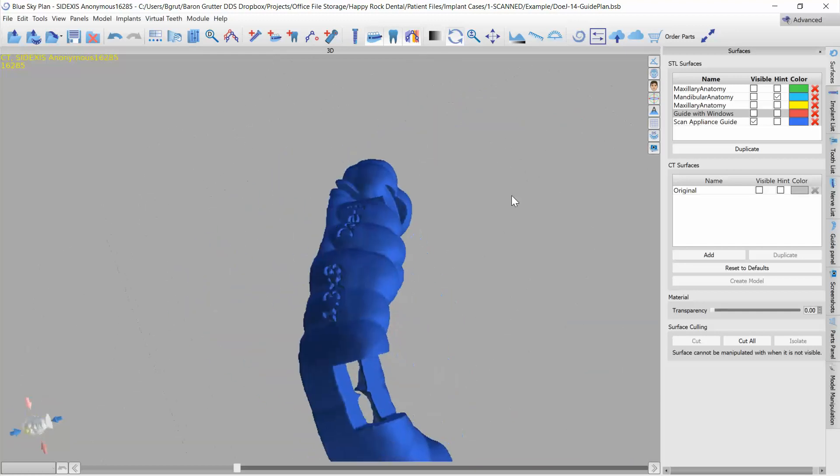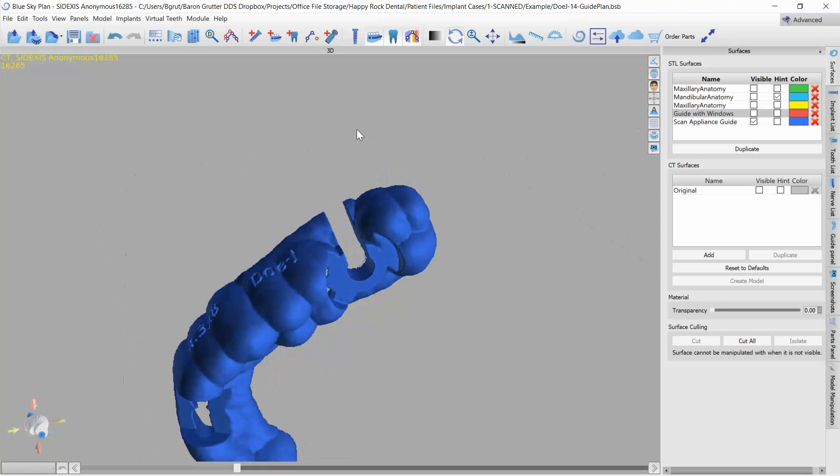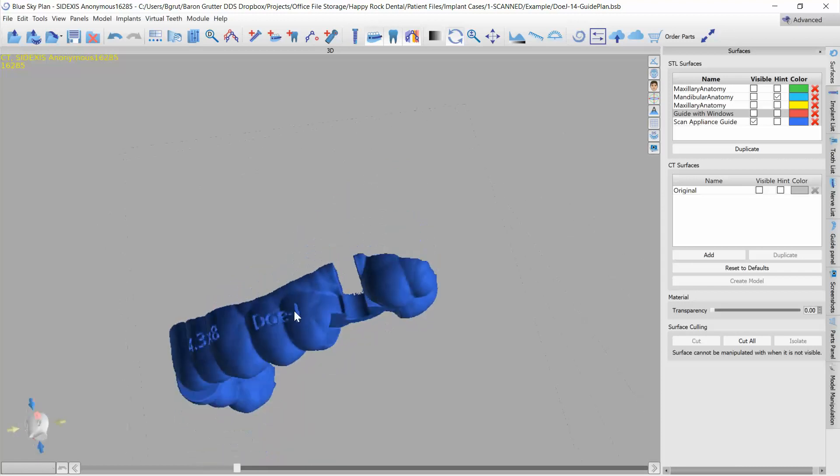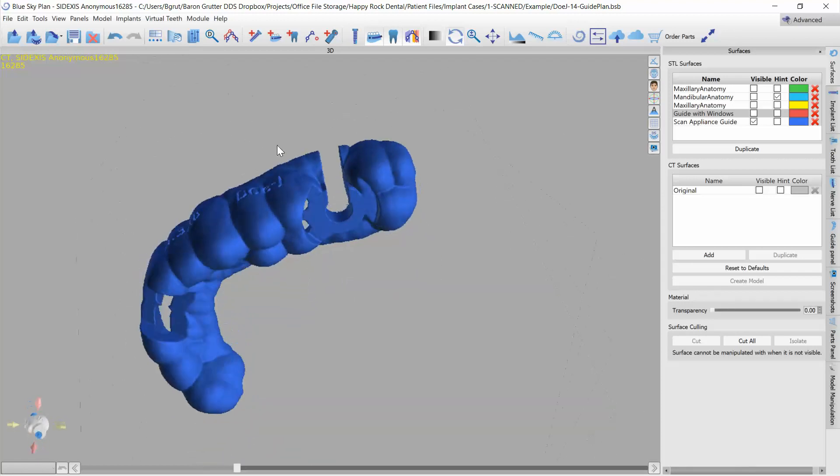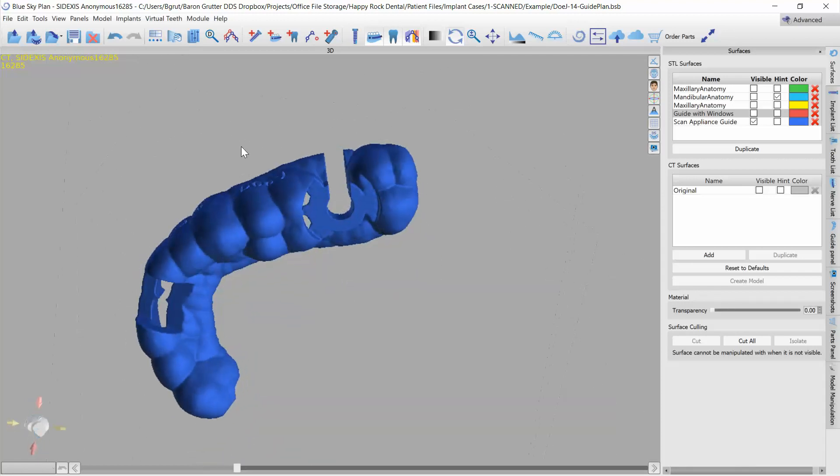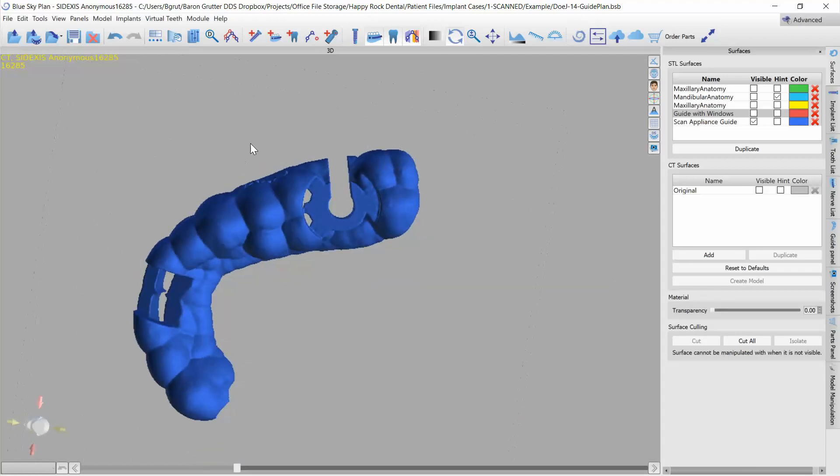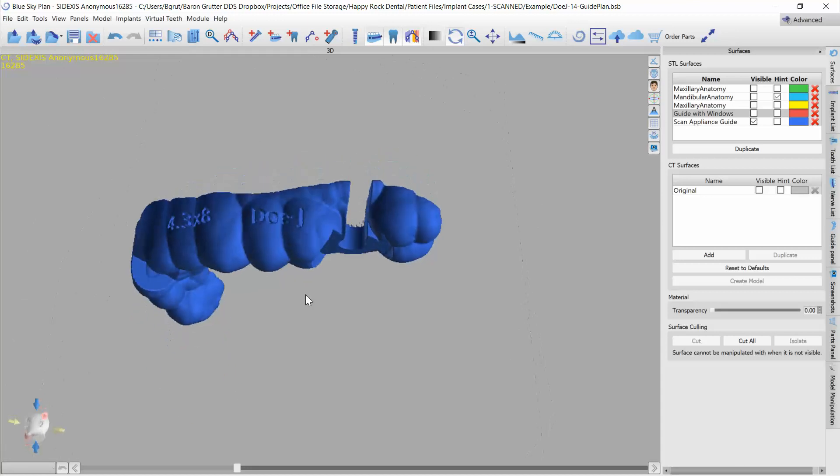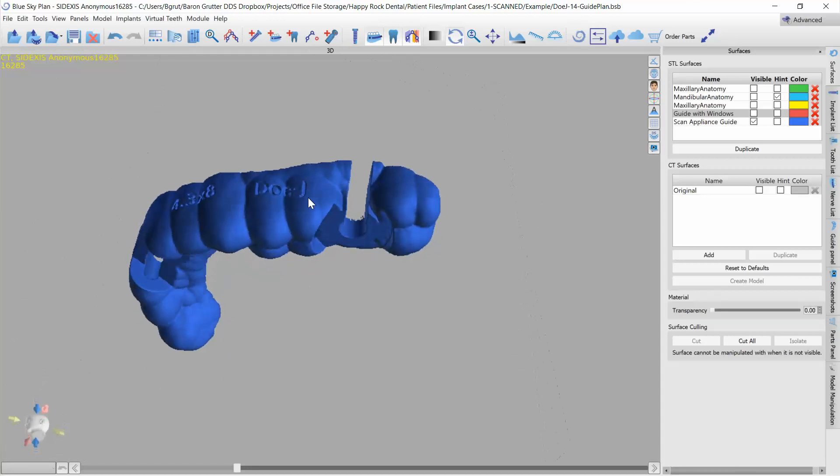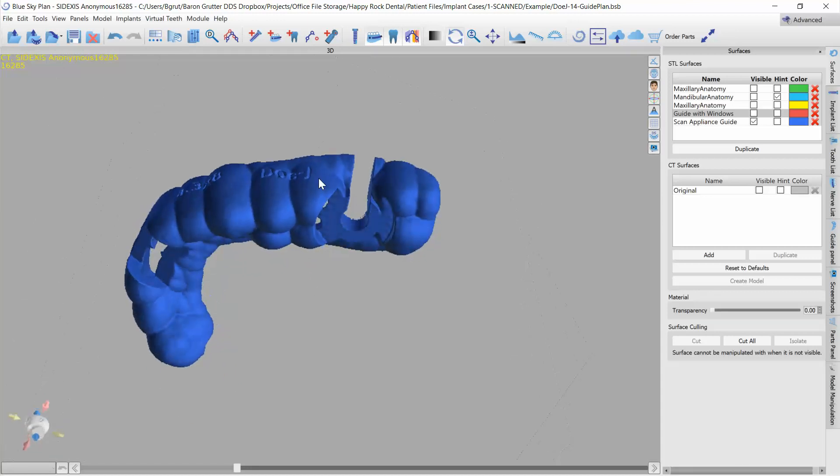Create your guide, go ahead and line up your little channel and hit create surgical guide, or if you know ahead of time you can just add the window when you're first designing your guide and you don't have to worry about the scan appliance guide.